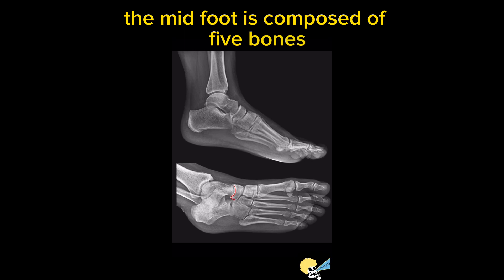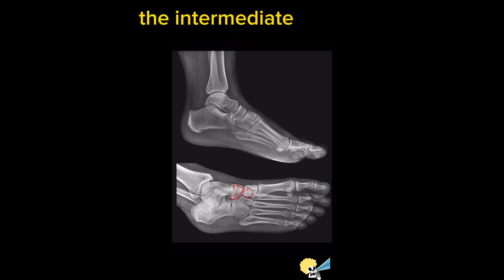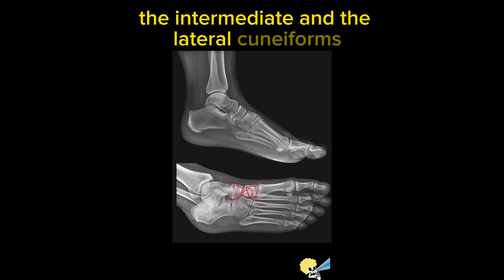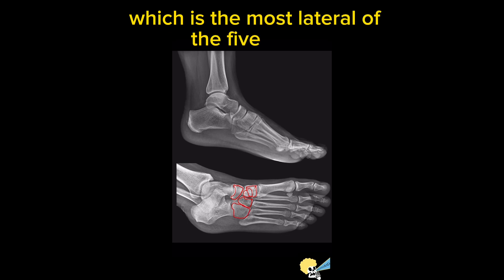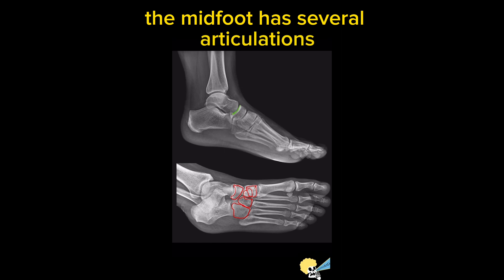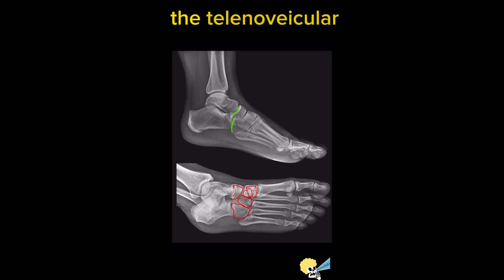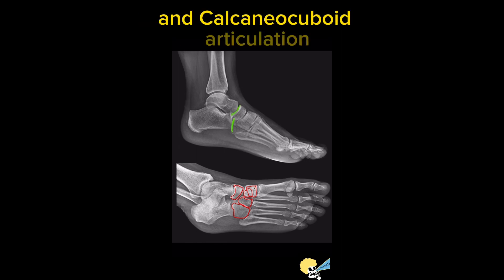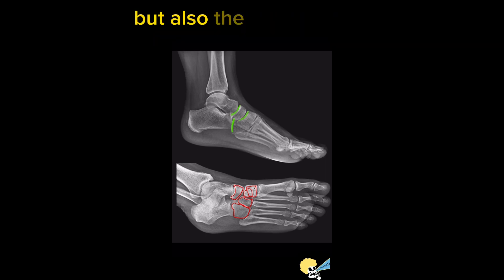The midfoot is composed of five bones: the navicular bone, the three cuneiforms — medial, intermediate, and lateral — and the cuboid bone, which is the most lateral of the five bones. The midfoot has several articulations, but three important ones are the talonavicular and the calcaneus-cuboid articulations, which are part of the two-part Chopart articulation.